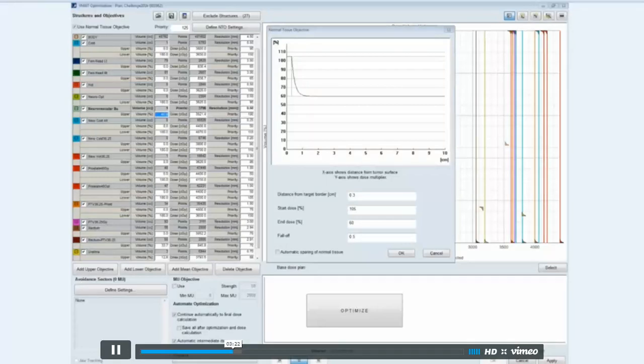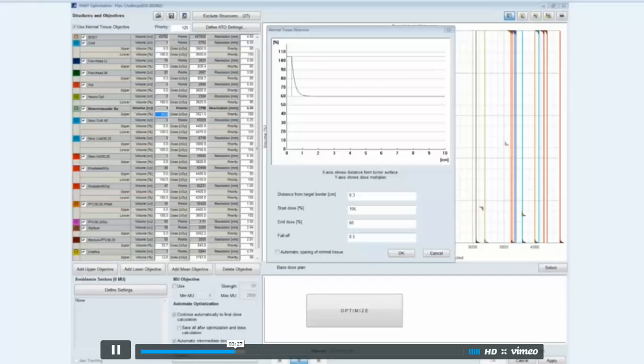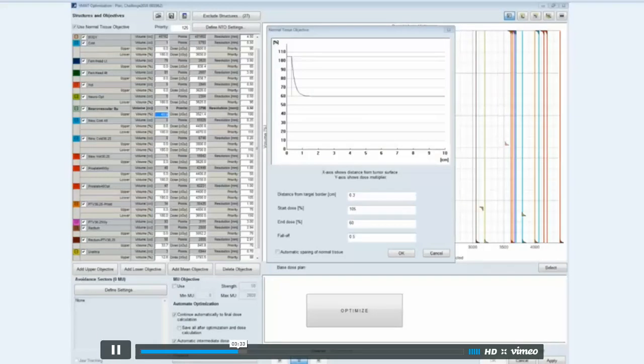Once I'm satisfied, I add constraints to all my organs at risk, and the whole time I keep it paused and just let it run its course, let it fully optimize. But once everything kind of looks good, I release it and let it move on through the steps.